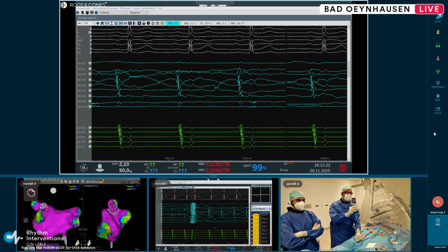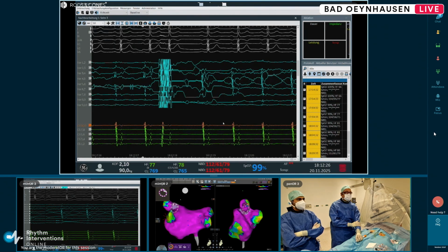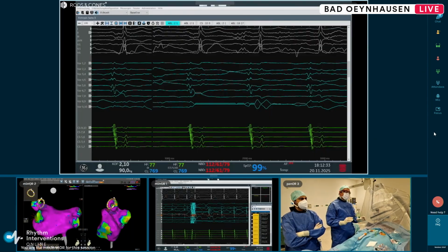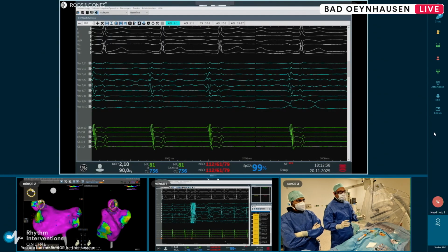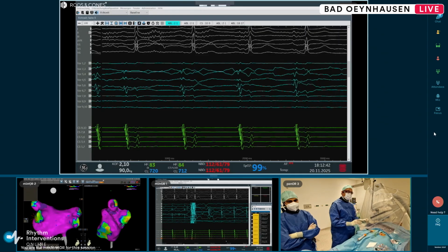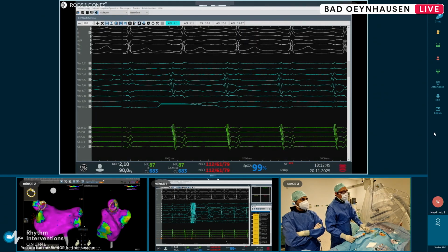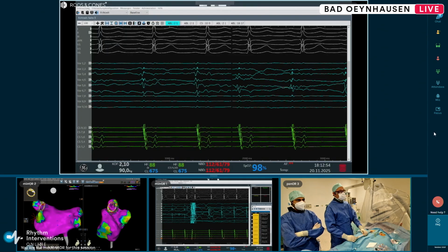And you can also see that around the area where we ablated is now what we call a grid cloud, which shows you good TPI and good coverage of the patient. While we now see the patient a bit coughing, we also have the possibility to see where good TPI was already achieved with ablation, which is then highlighted in green color. And on the other hand, you see that there is sometimes red color, which shows you, let's say, potential gaps or areas where no good TPI was achieved.